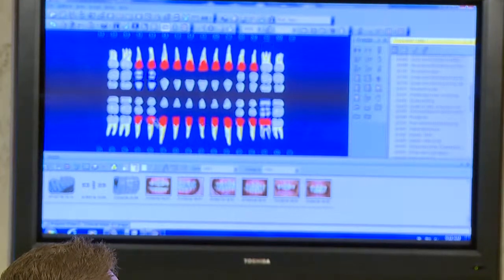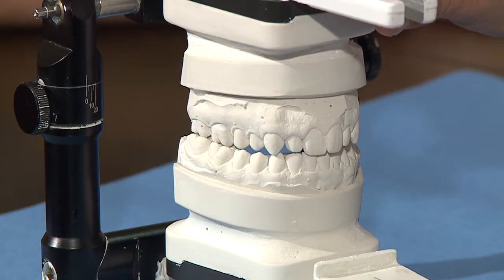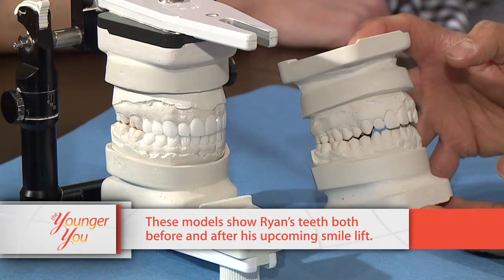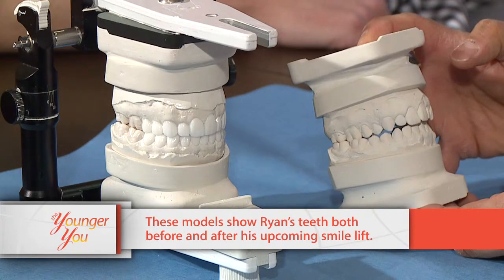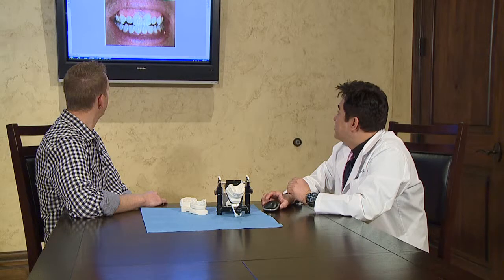I'm Ryan Reiser and I'm 35. How you doing, Ryan? How are you? Okay, what we plan to do today is we're going to be prepping all these teeth. They'll be able to accomplish closing up your bite. This is your current bite right now. My bite isn't what it should be. I only contact in a couple areas, and because of that it causes wearing in those areas and not in others, and causes headaches, things like that. Remember that you actually been biting on your posterior teeth only. We'll be able to get you out of the crossbite that you have on the left side and on the right side. So today you'll be able to get a new smile. That'll be nice. Are you excited with that? Nice, yeah. You'll be able to actually use your front teeth and have a better bite. You mean I'll be able to use all my teeth, not just a couple?